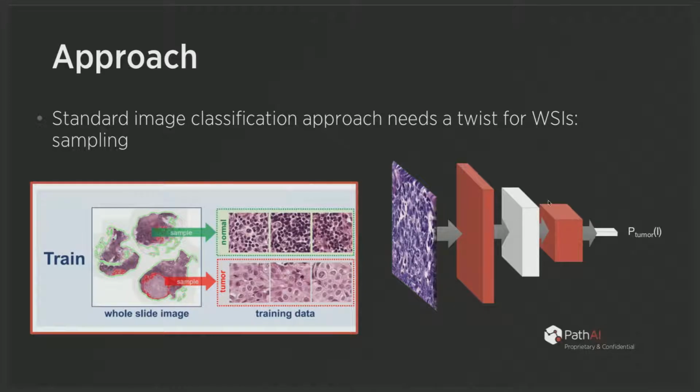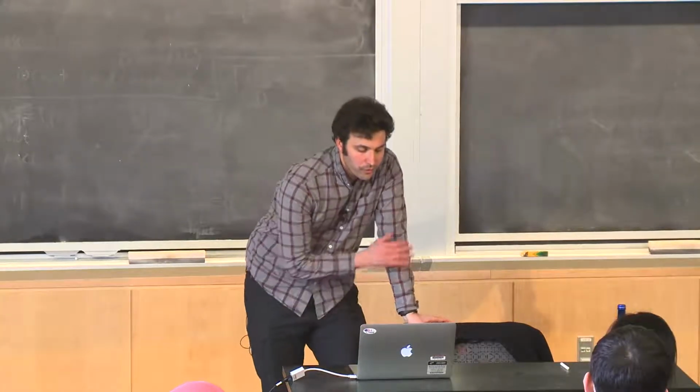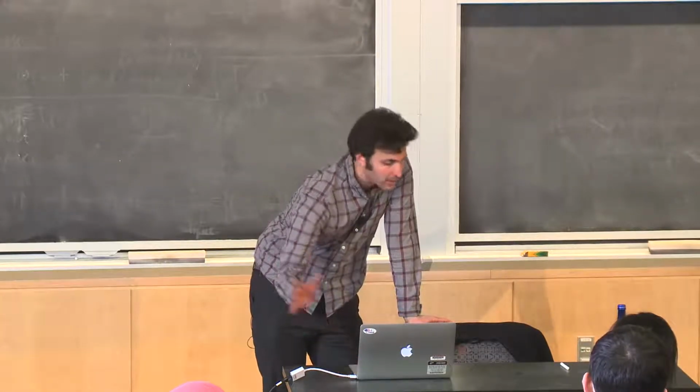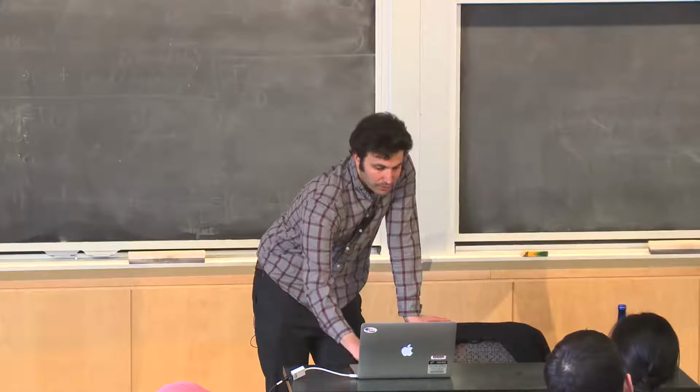And for that, we do this process where we start with a labeled data set, where there are these very large regions labeled either as normal or tumor, and then we build procedures, which is actually a key component of getting machine learning to work well, of sampling patches of images and putting those patches into the model. And this sampling procedure is incredibly important for controlling the behavior of the system, because you could sample in all different ways. You're never going to sample exhaustively because there's far too many possible patches. So thinking about the right examples to show the system has an enormous effect on both the performance and the generalizability of the systems you're building. And some of the insights we learned was how best to do the sampling. But once you have these samples, it's all data-driven.